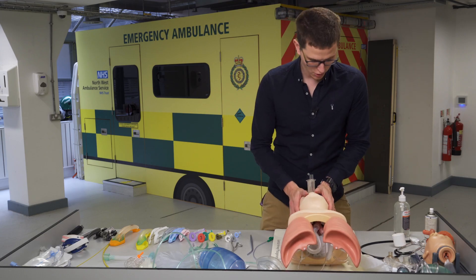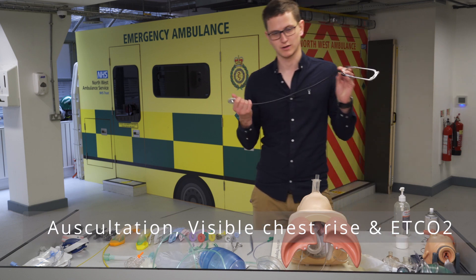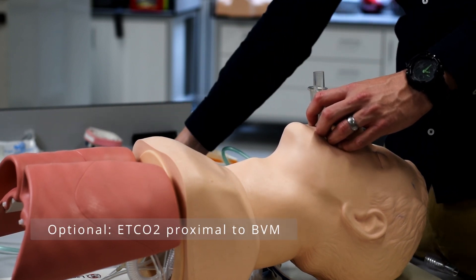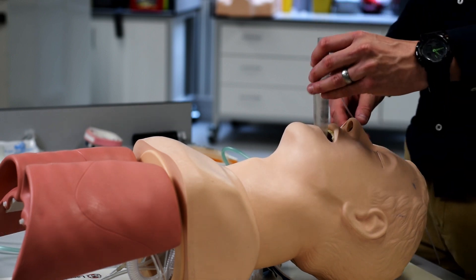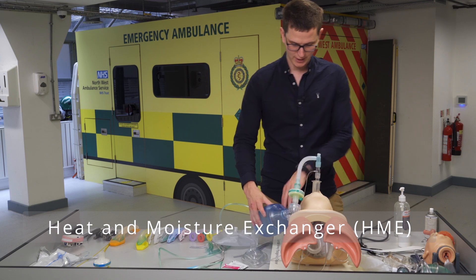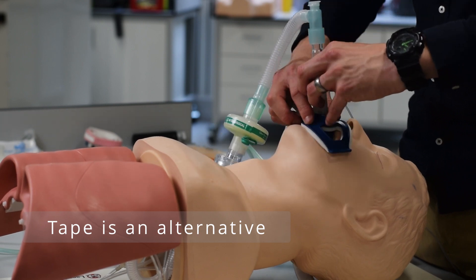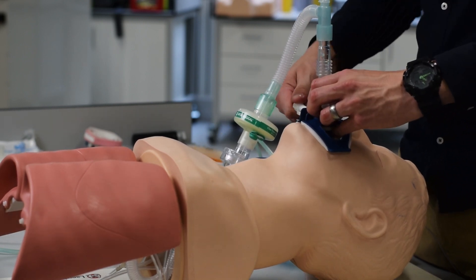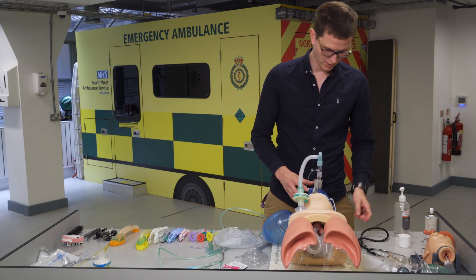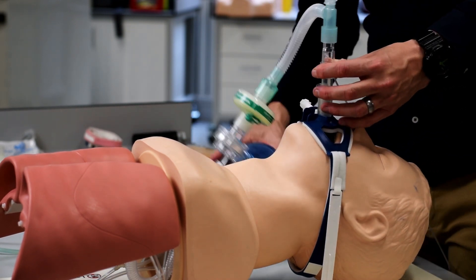Once we start ventilating we can confirm placement. Once you have your iGel in, attach your capnography — which should be as close to the patient as possible — then your catheter mount, and then your HME filter. The Thomas tube holder gets attached and that is your complete setup with capnography, catheter mount, and HME filter attached to your BVM.